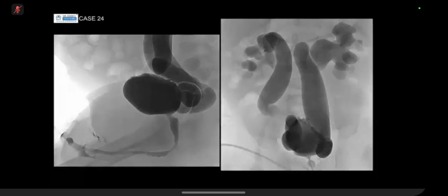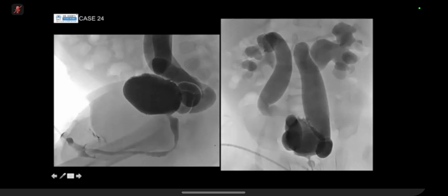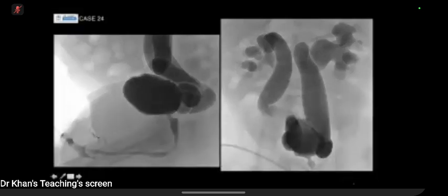Okay, does the bladder look abnormal? Yeah, that looks abnormal. That looks like a regular trabeculated appearance with small. So you have to remember that the child is probably, this is a dynamic study, so if you look on the lateral where the bladder's relatively okay distended, what do you think there? So again, this can be then isolated abnormality of the bilateral vesico-ureteric reflux.